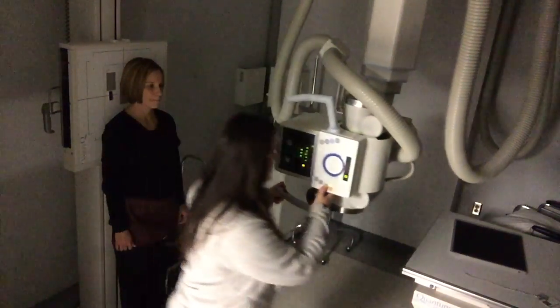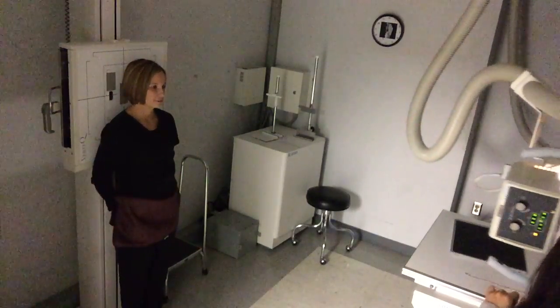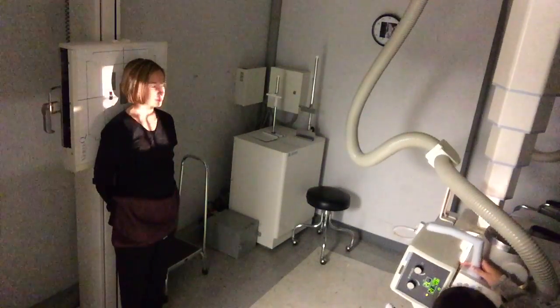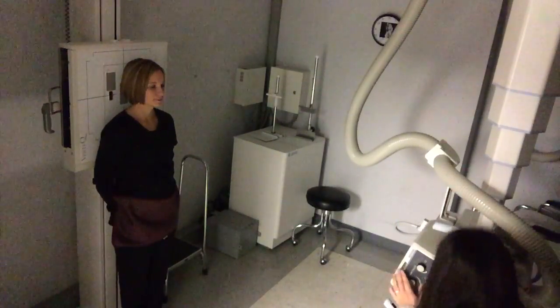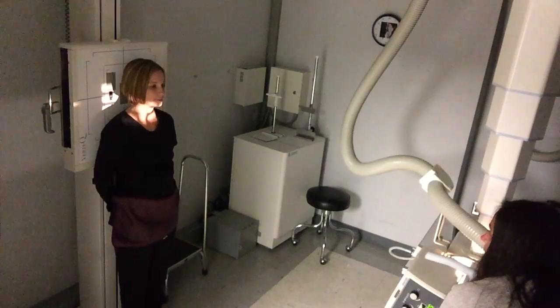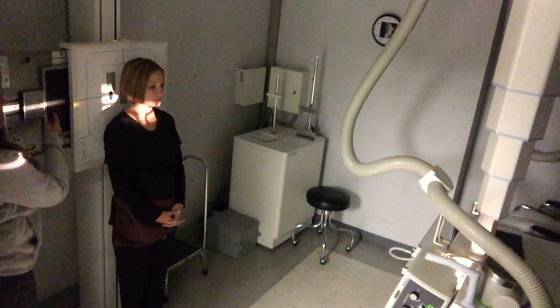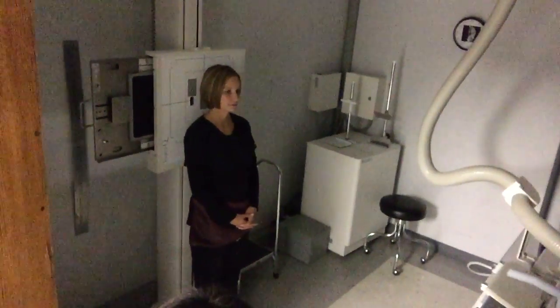For the next two projections, I'm going to back up to 72 SID. I'm going to start with the AP projection since her back is already against the board, so she doesn't have to move. I'm going to angle my tube up 15 degrees. Then I'll lower my tube down and get it in the ballpark. I'm looking for her Adam's apple, or C4, and that's where I'm going to center. With an angle like this, we are looking to see that we're lined up with our cassette, not necessarily our actual Bucky.